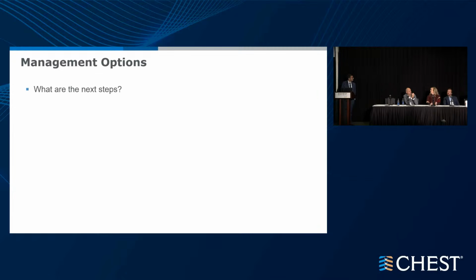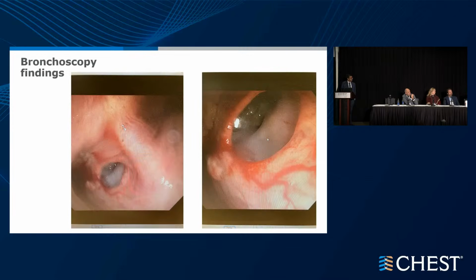So it's really a bronchoesophageal fistula, right? Yeah. Can you go back to the image, just so I understand it? The image on the left is LC2 with upper lobe and lower lobe? No, this is the carina, and then there's the fistula in the proximal left main stem. That's the main carina? Yes. Okay. Because I heard left main bronchus. So that's main carina, right is fine, maybe mild compression, and then fistula very proximal. And then how did the left main bronchus look? Was it open? Yes, it was open. And the second picture is just a closer view of the hole. Close-up, yeah. Okay. Thank you all.